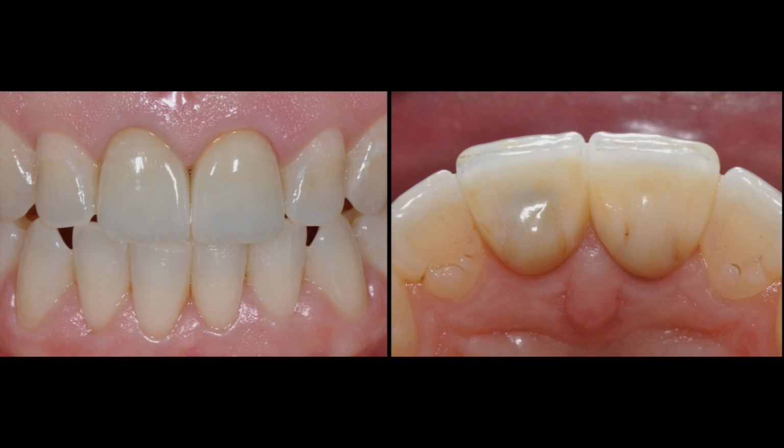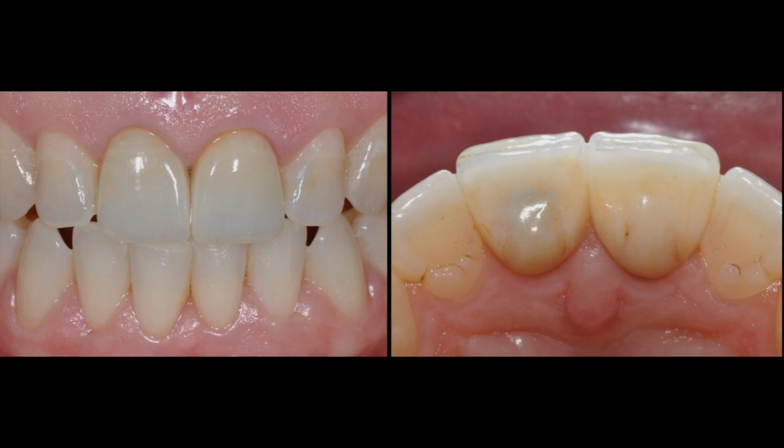Here are the definitive restorations. The translucency is achieved mainly with layering porcelain at the facial and incisal edges, whereas the functional aspect on the palatal aspect of those restorations is made of lithium disilicate, which is a material that is more durable than conventional veneering porcelain.